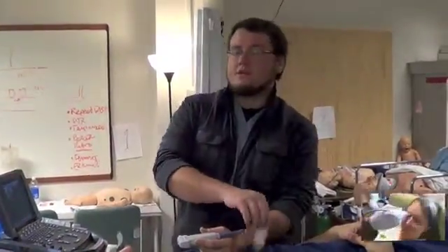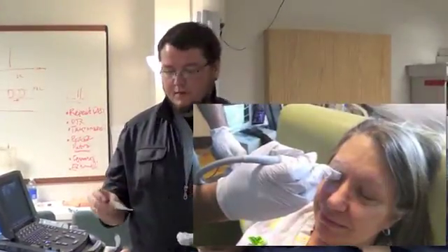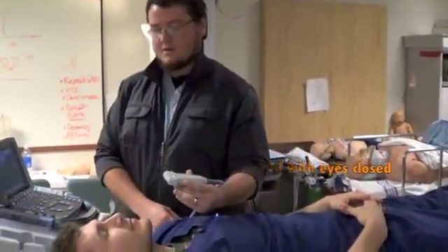There are two ways to prep the patient. You can use a Tegaderm and apply this prior to applying jelly, but you can also use sterile jelly and apply it directly to the eye. You can use a fair amount of jelly to get a good image.